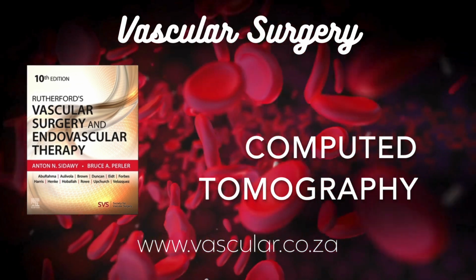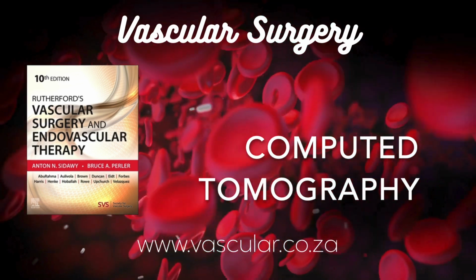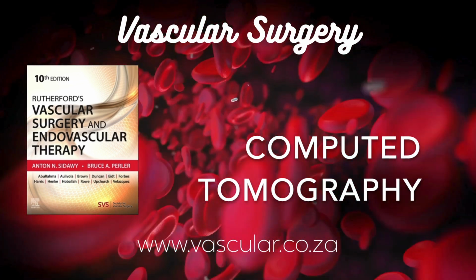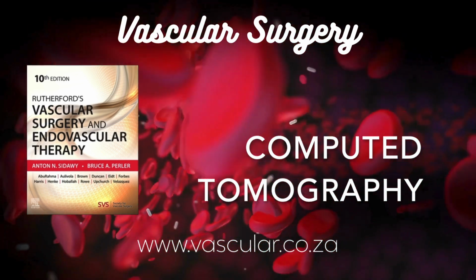How does CT stack up against duplex ultrasound and MRA, summarizing the pros and cons? Duplex ultrasound. Great for screening, non-invasive, no radiation, gives flow info, but very operator dependent, can be limited by patient size, gas, or heavy calcification, and often doesn't give the full anatomical map needed for complex endovascular planning.